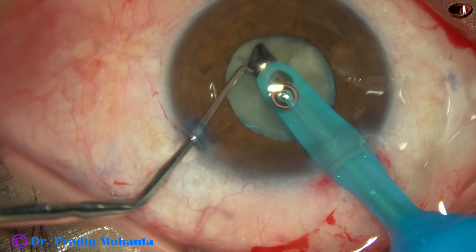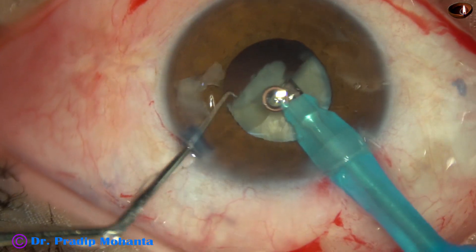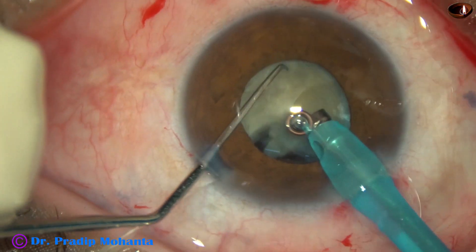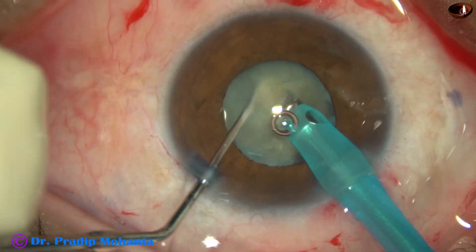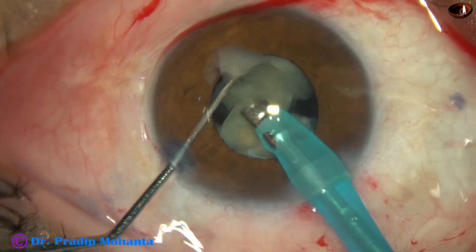And here what happens — the pupil is becoming small. Size of the pupil is about 3.5 mm now. However, still the case can be managed without using iris hooks or any pupil expansion device.